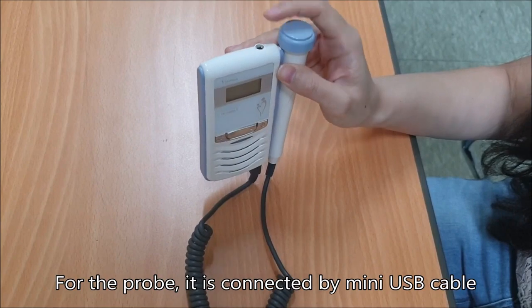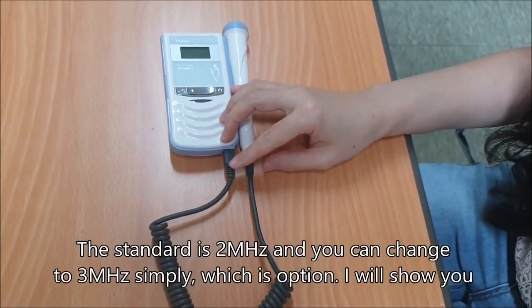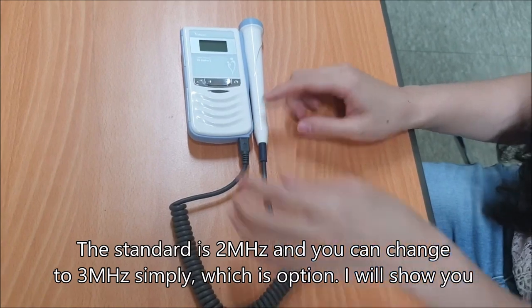For the probe, it's connected by mini USB cable. The standard frequency is 2MHz and you can change to 3MHz simply with this option. I'll show you.